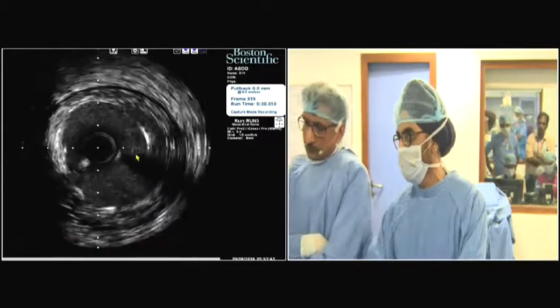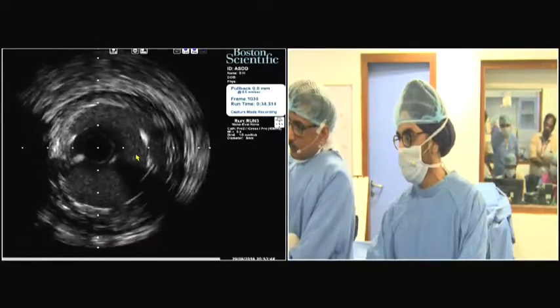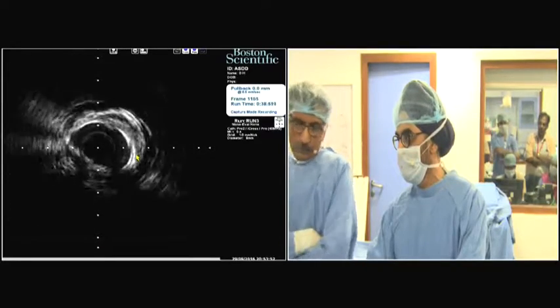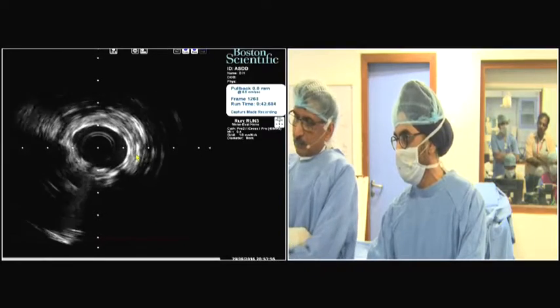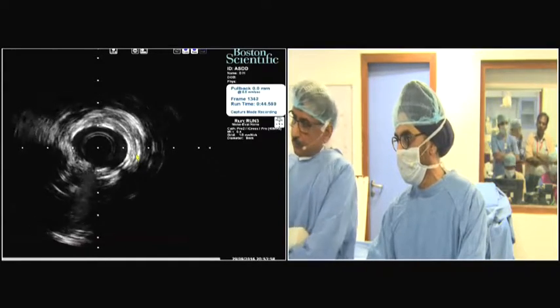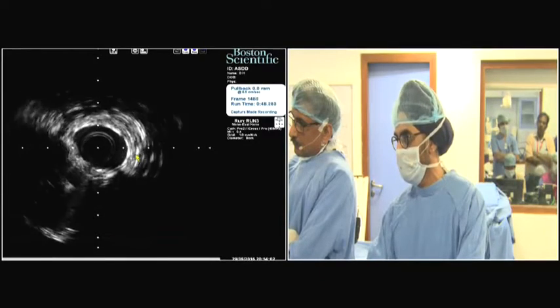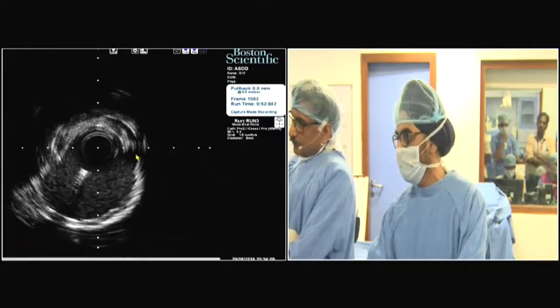Yeah, but I suggest to use a large non-compliant balloon to dilate the ostial diagonal again. I may do that. You agree? Yeah, I will go high pressure there because I did 12 atmospheres kissing at that point, so at this point we can do a much higher pressure with a 2.5 balloon because the size is not bigger than that.